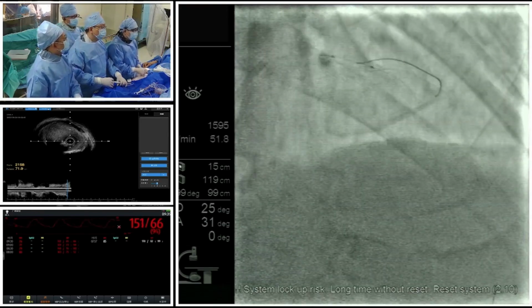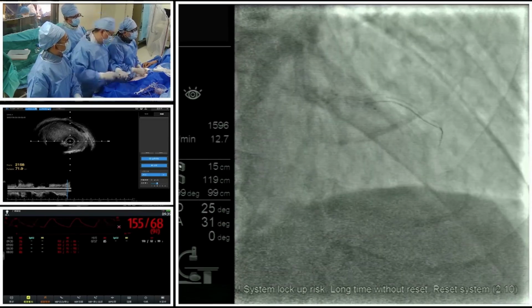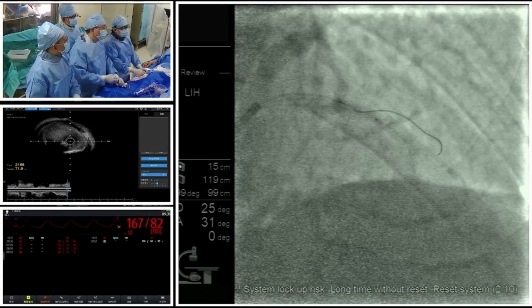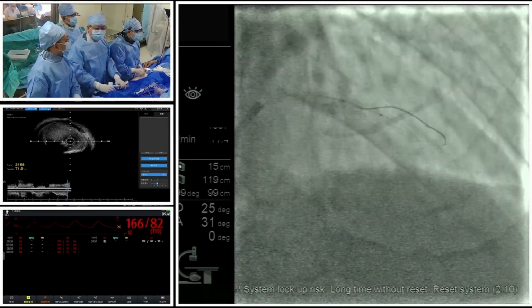I think it's a very useful technique, because the virtual stenting can give us a lot of guidance, like where and how to put the stents. And also after stenting, according to the virtual stenting, we know there will be a huge increase in terms of the QFR.